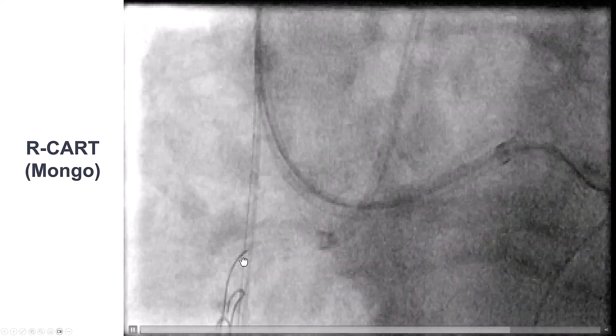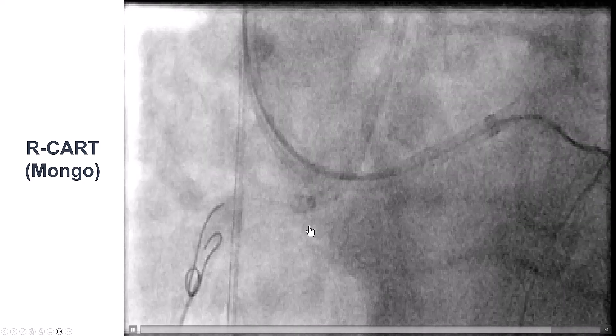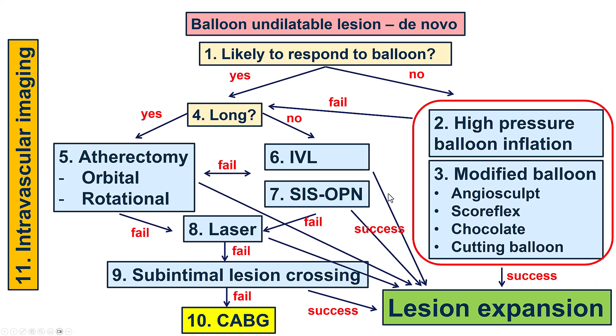We advanced the retrograde Mongo and tried to do the reverse CART. We were able to externalize the guidewire and then tried to predilate. Using non-compliant balloons up to 26 atmospheres, unfortunately we had a waist, indicating a balloon undilatable lesion in the proximal to mid-right coronary artery.